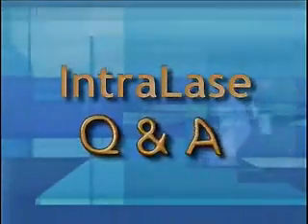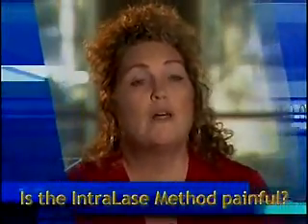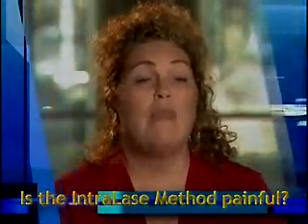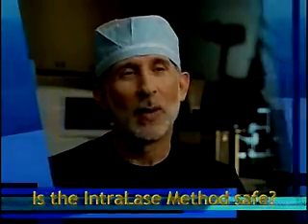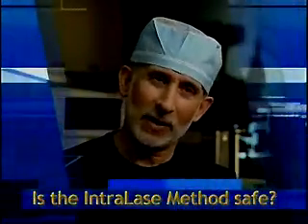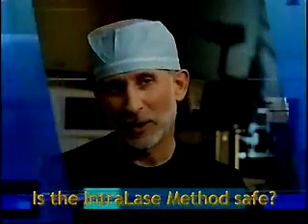The IntraLase method was not painful. What I felt was a little bit of pressure at first and then really nothing, and then it was over — it was just so fast. What I tell all my patients is that the reason I choose IntraLase is because of its safety. It's absolutely the safest method of creating a flap. And it also increases the accuracy of the procedure, so the chances of getting perfect vision are the highest by using IntraLase.